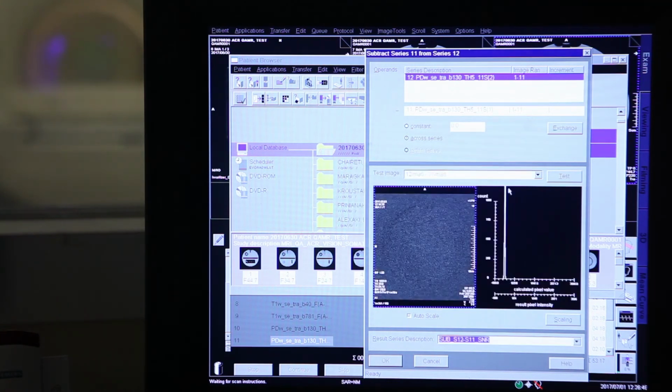So here you see all the distribution of the signal, of nothing actually. In order to have the rest of the distribution, exactly. And that's the trick. You are measuring on this subtract image, and not on the other one. So I'm going to put SNR2 in this case, in order to see the difference when we make the statistics.